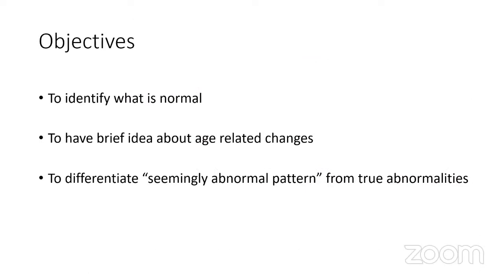So when the source of these activities is external to brain, those are the activities which we refer to as artifacts. Now, artifacts do not help us in making a diagnostic impression, but it is very important to know about the artifacts because they may be misdiagnosed and taken as some abnormal finding, which it actually is not.